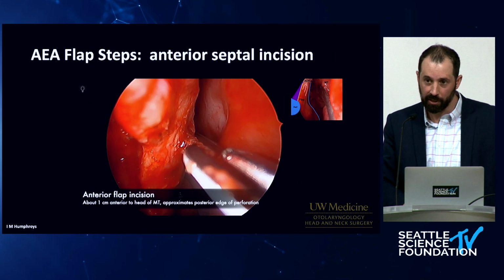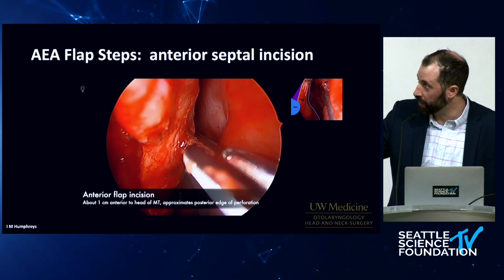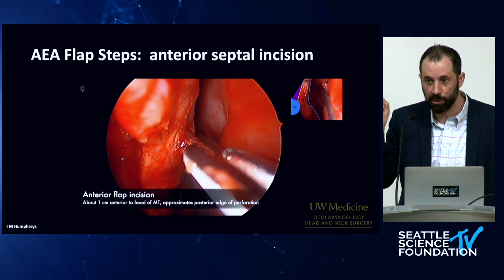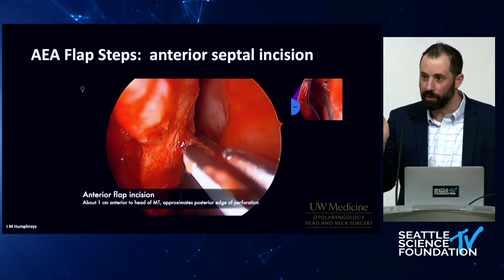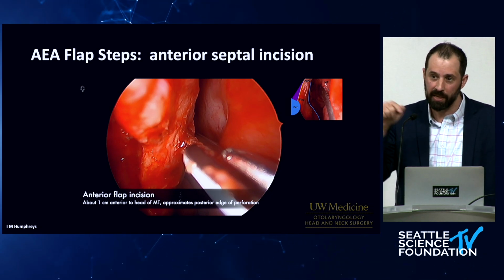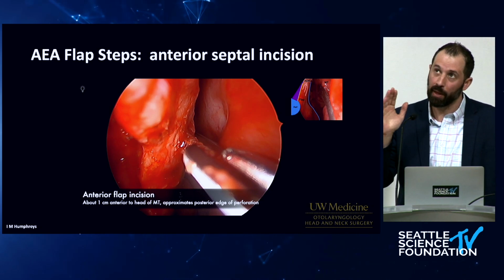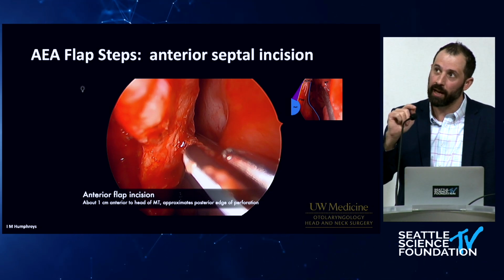Here's making the anterior incision. Now, what I'm not showing well here on the main picture, but in the insert I'm trying to show, is the key is there's a separation between that blue line and the yellow line, which are your two incisions. The reason for that is your perfusion point for this flap. Everywhere else is going to be incised, and the rest of the dimensions of this flap, that's going to be your pedicle.